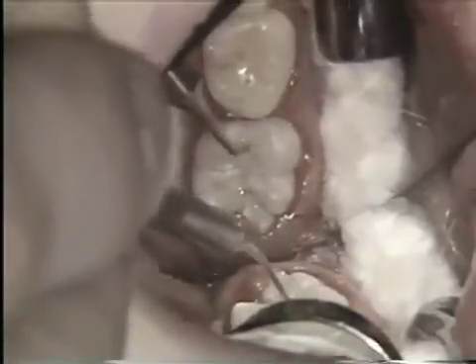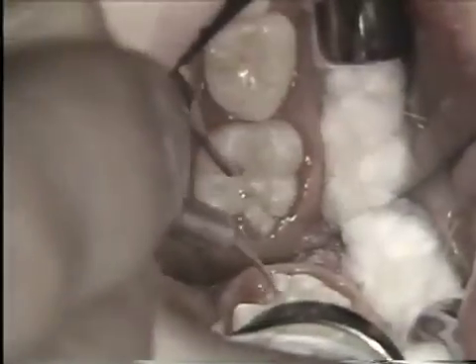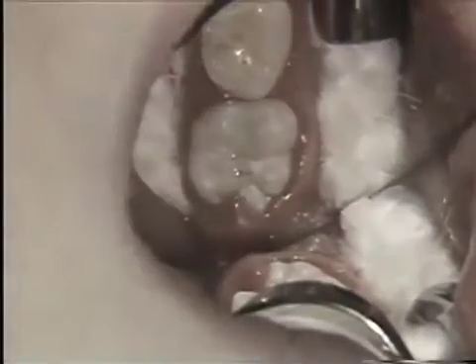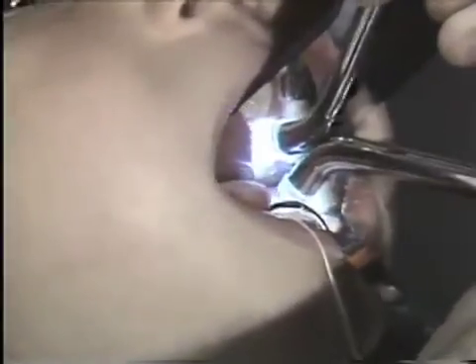The third increment is placed in the central area and nursed up into the mesial pits and out the buccal and lingual grooves until we get complete coverage. If it appears shallow, another increment is placed over the existing sealant and readapted to all the grooves. Once satisfied with adequate coverage, the light wand is held about a millimeter off the occlusal surface and the sealant is exposed to about 20 seconds of light activation towards the mesial, then another 20 seconds held more towards the distal, ensuring complete polymerization.